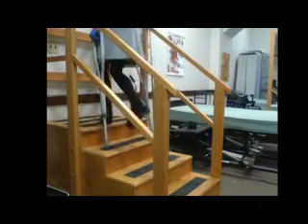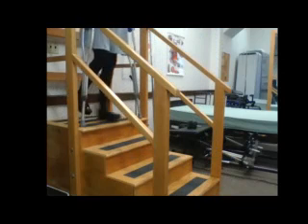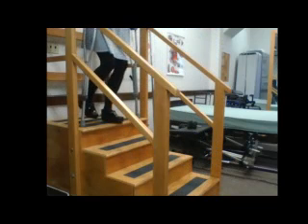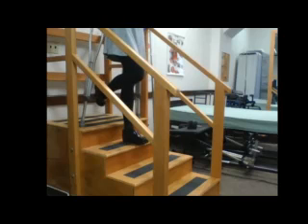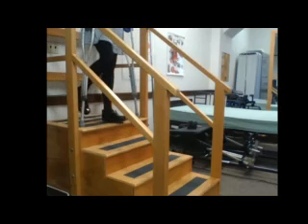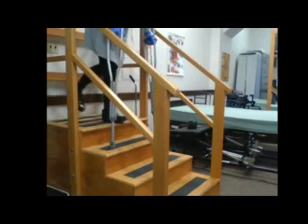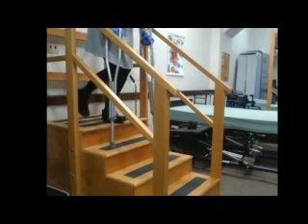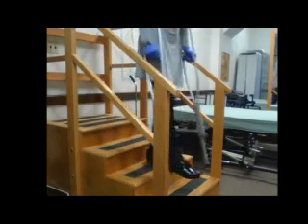You are also going to stay in the same position as I was whenever she was on the cane. Now, if I leave my crutches up and I put my foot down, I'm going to be in a similar situation. Look comfortable? No, not safe. So, whenever we go down, we're going to put our crutches down. The other thing we want to cue our patient to do is to kick their foot forward. If they leave it back, they're going to hit it off the step on their way down. Crutches down, and then good foot.